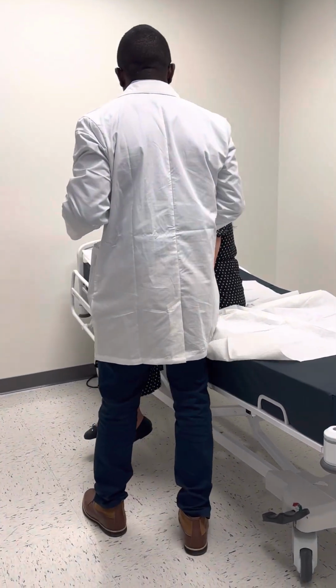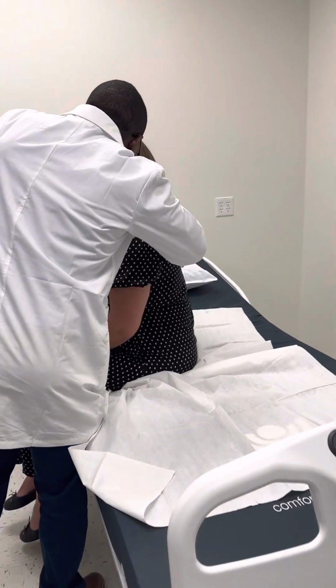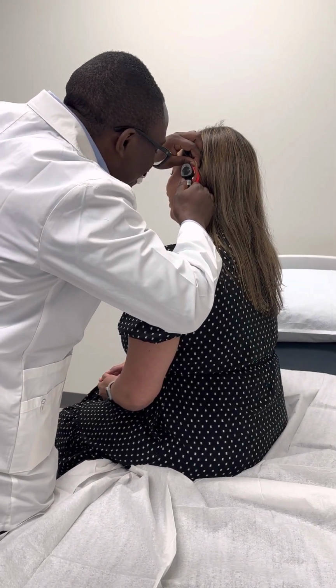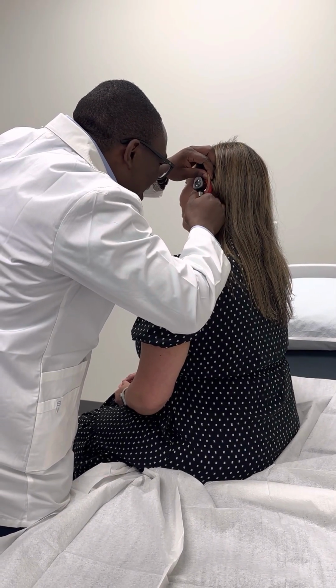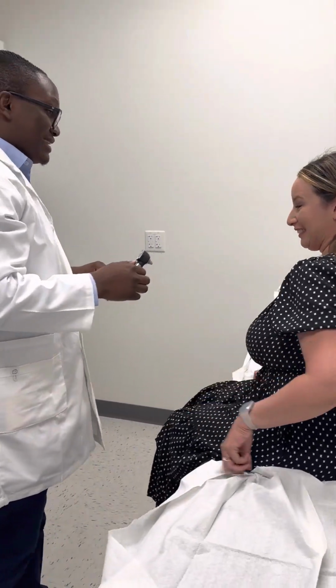So we're going to assess the left ear. The ear canal is clear, there's no wax. I can see the tympanic membrane, it's translucent. The cone of light is at 7 o'clock. Looks normal to me. Good. Thank you.